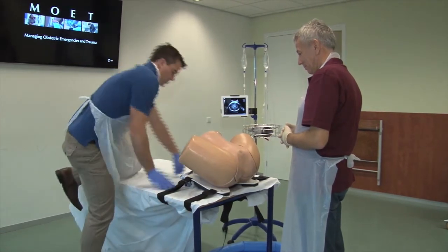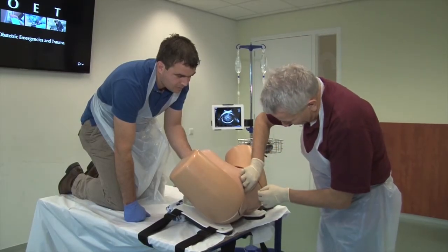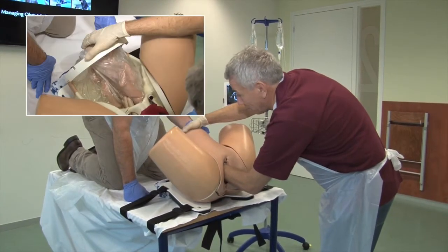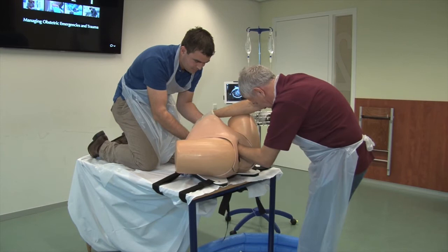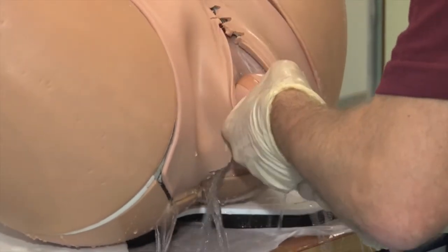The manikin is then put in the lithotomy position and the instructor simply supports the plastic bag containing the fetal manikin and water. The obstetrician enters the pelvis with the hand that is on the same side as the fetal abdomen after lubrication. The external or abdominal hand initially supports the fundus and later can assist in rotating the fetus into the longitudinal lie. This setting allows the candidate to palpate the fetal feet through intact membranes. Both feet or the anterior foot is grasped, flexed and pulled through the intact membranes, during which the membranes will rupture spontaneously.